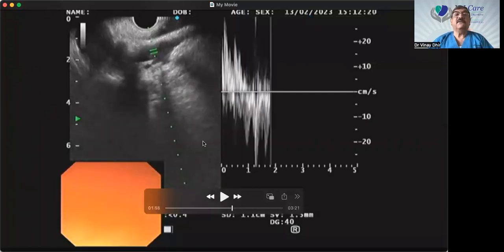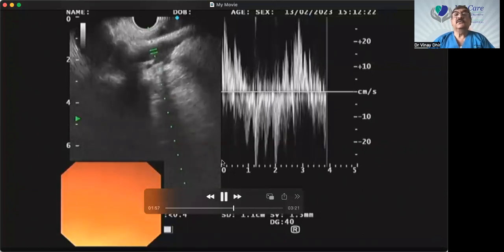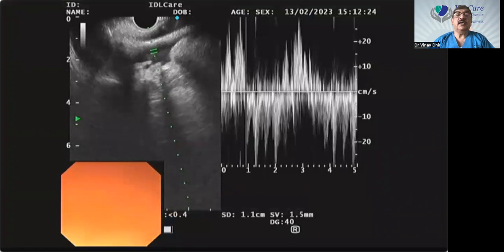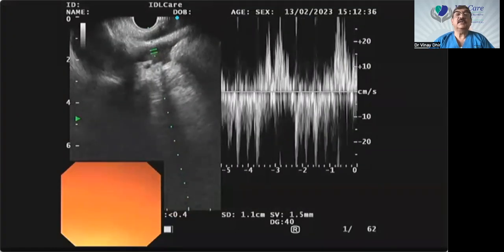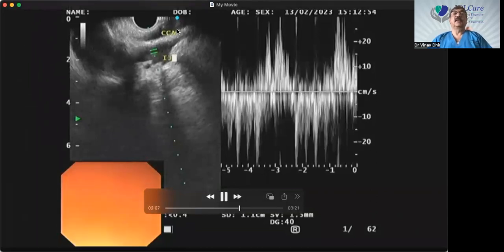Here I am confirming whether this is a vein or an artery. You should use your Doppler to find out whether it's a vein or artery — no need to get confused. This is a vein, so we are right. Common carotid and internal jugular confirmed. This is the station 2 area.